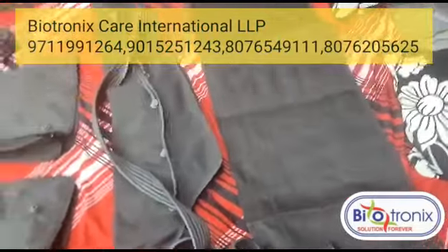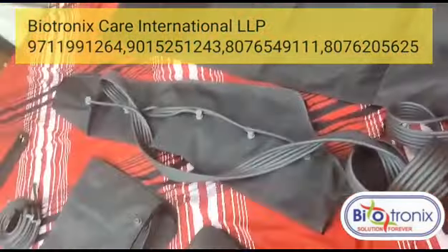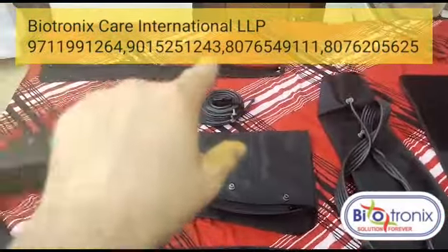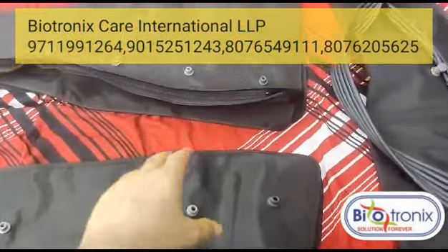These are the attachments: this is the waist attachment with six chambers, this is the arm attachment with six chambers, and these are the two leg attachments. These are the connecting tubes, and this is the extension — for cases where the size of the leg is bigger.